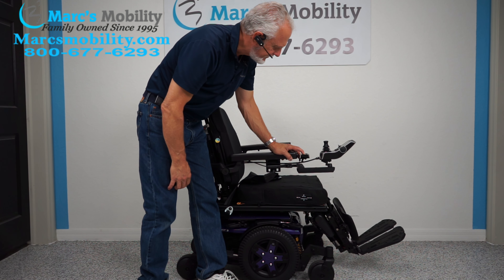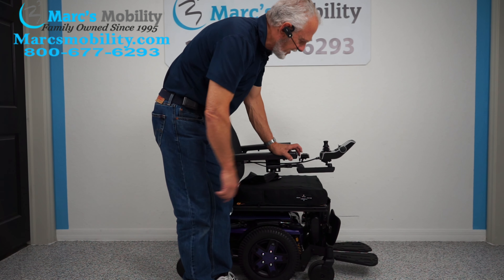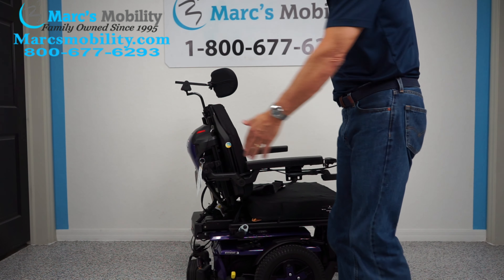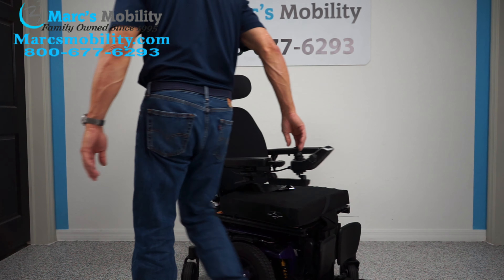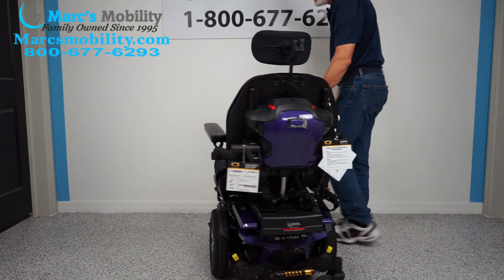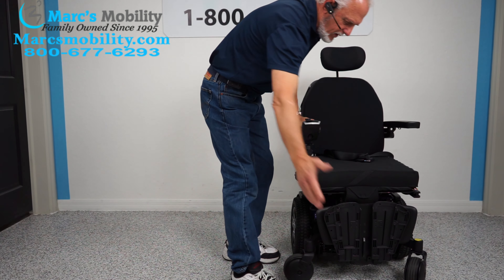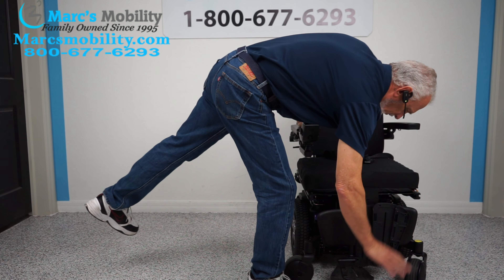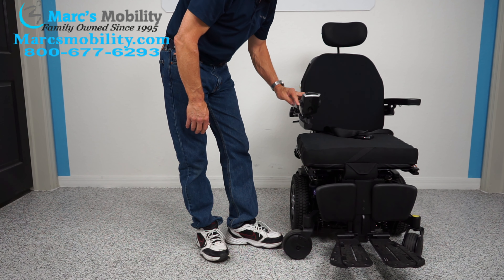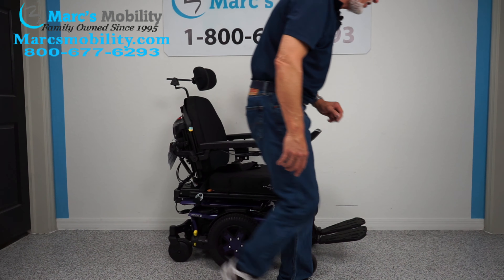If you turn this chair in a circle in your house, bring your legs all the way in and your turning radius will be a lot better. So I'm bringing the legs all the way in — now look, this chair will turn in a circle pretty much the length of the chair. It'll turn like this either way on its own length. When you exit the chair, you can flip up the foot plate and walk right out, or transfer from the side. In the house, you'd want to keep your feet all the way in for a shorter turning radius.